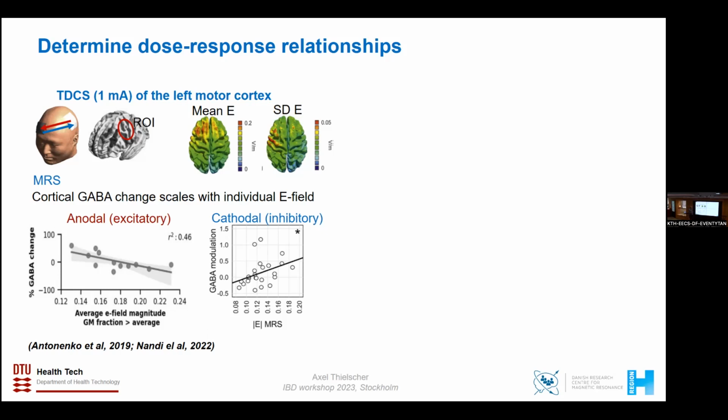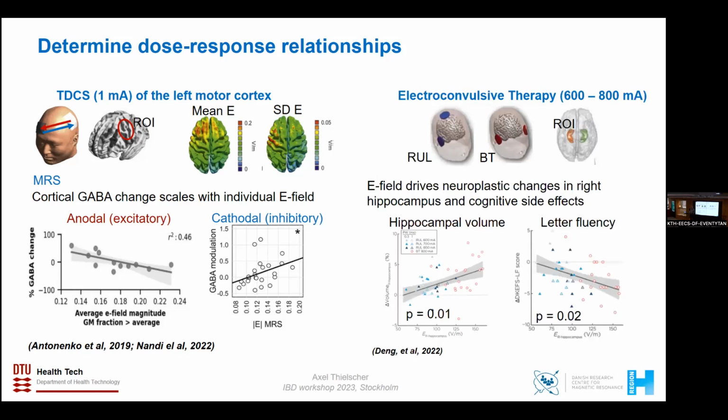But it's showing that it's going in the right direction. We can demonstrate dose response relationships. A very different dose response relationship is shown here.